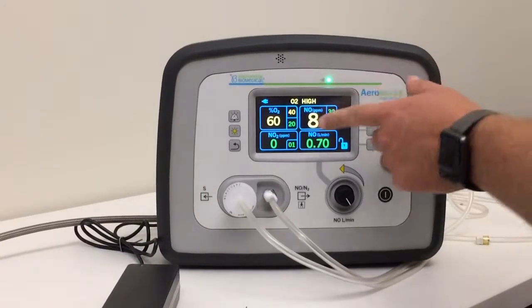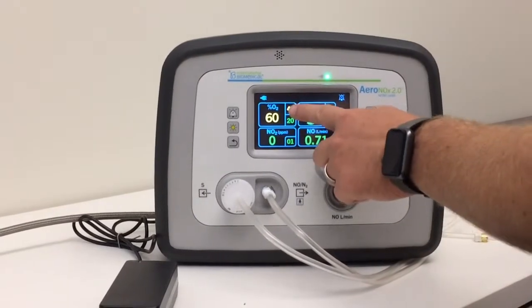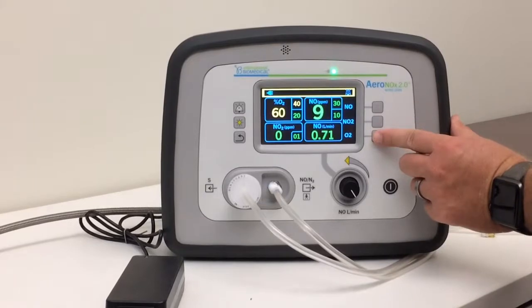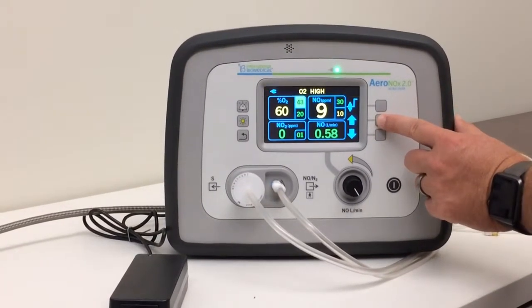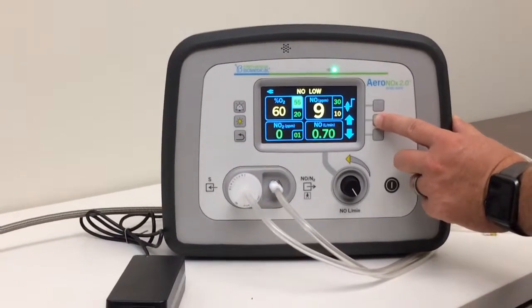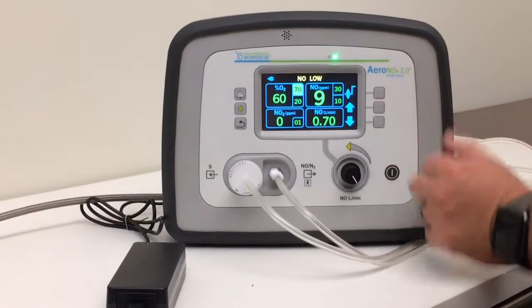You see over here our O2 is high. We're going to silence this alarm, and we're going to go ahead and crank up our O2 alarm — we're going to hit this and go up on our O2 high limit, just so we don't have a problem with that alarm anymore.